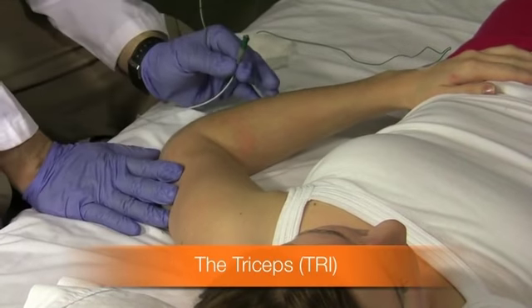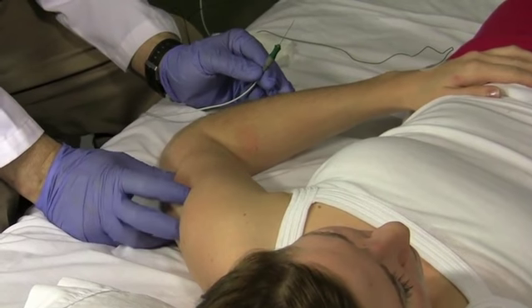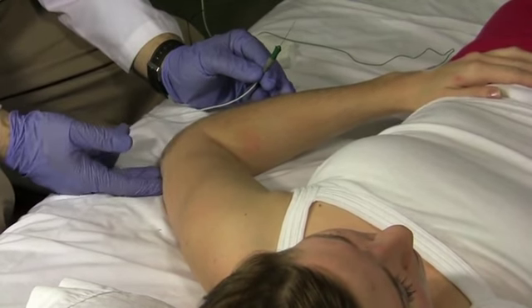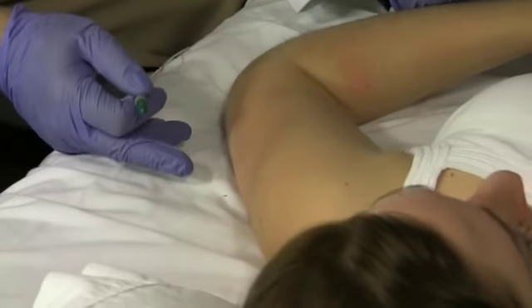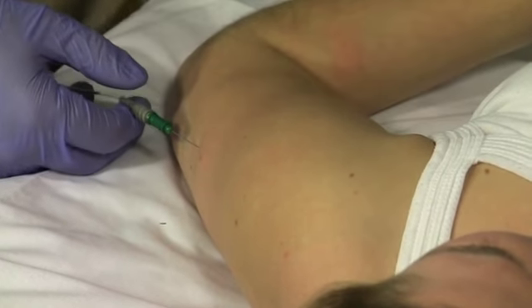It's a radial innervated muscle. It has some C6, C7, and C8 in it, actually. Very useful muscle because in C6, 7 root lesions, you might have an absent triceps jerk. So I get the triceps right here. Push down on my hand with your arm, and the triceps hardens up here. Here we go. 1, 2, 3. Stick. And that's the triceps.